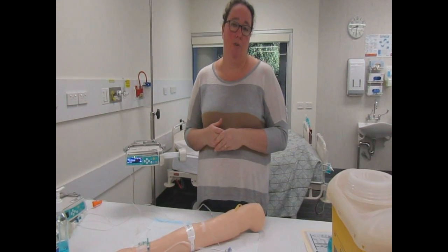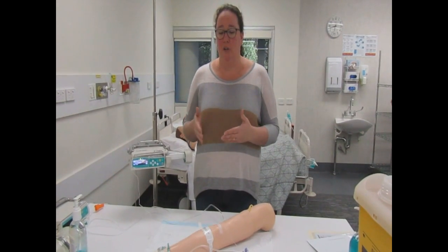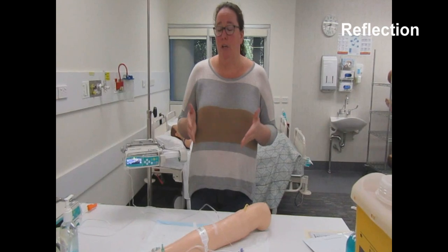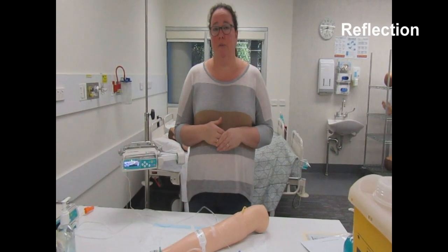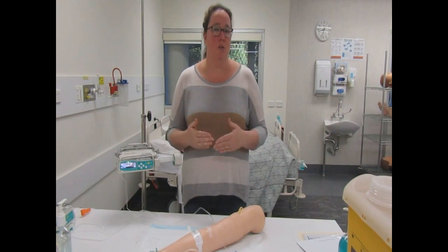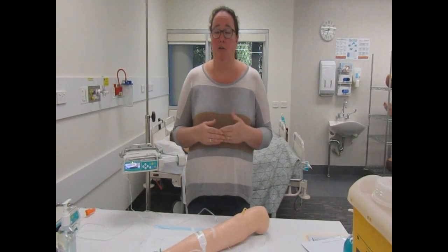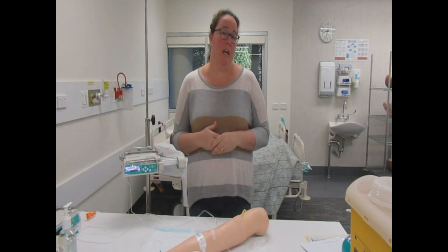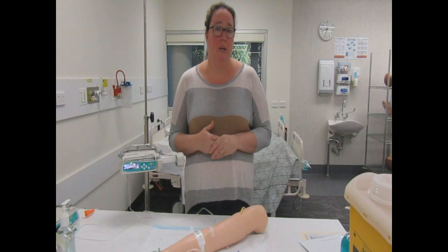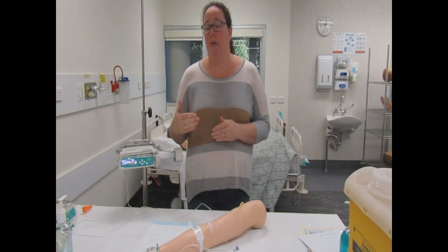Keeping a regular check on vitals, pain, and anything else the patient may report. Now that I've finished my procedure, one useful thing to do is reflect on how you went — particularly when you're learning and haven't done it before. Did you get all the equipment out? Did you know what you were doing? Did you feel confident? If not, what were the areas you weren't confident in? Go and practice, do some reading, talk to colleagues or peers about how you can improve for next time. Is there a knowledge deficit? Were there patient questions you were unable to answer, or support you weren't able to provide, and how might you improve that in the future? These are some reflective points to consider at the end of any procedure or care you've given. Thank you very much.